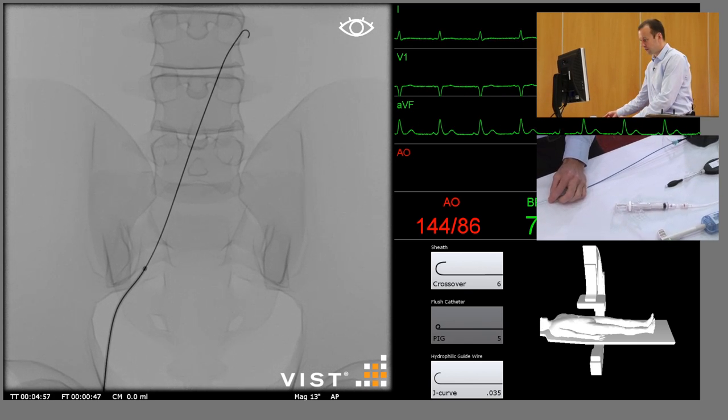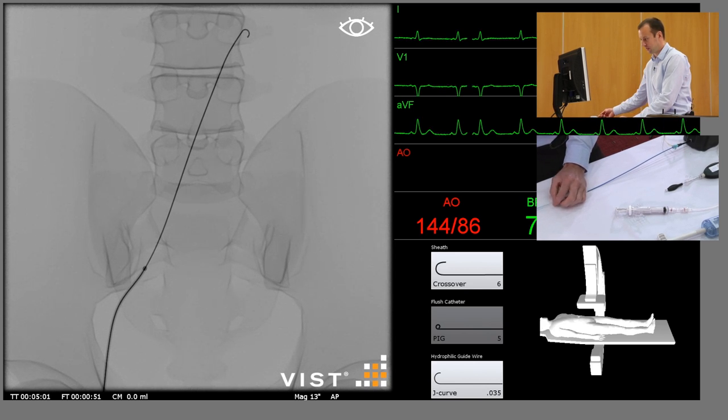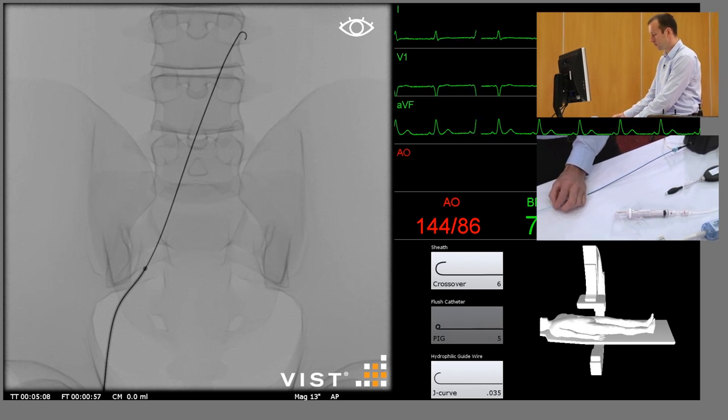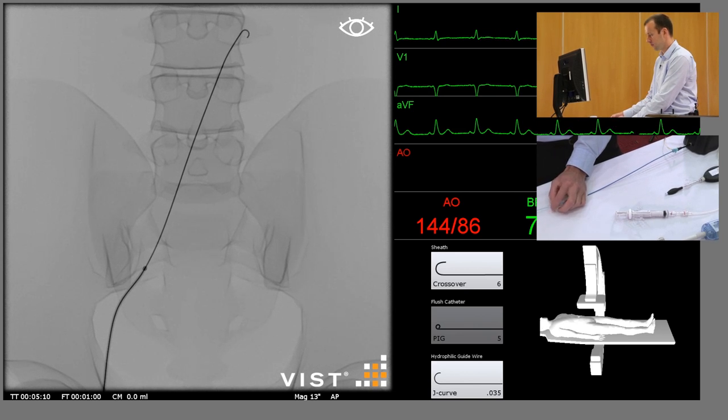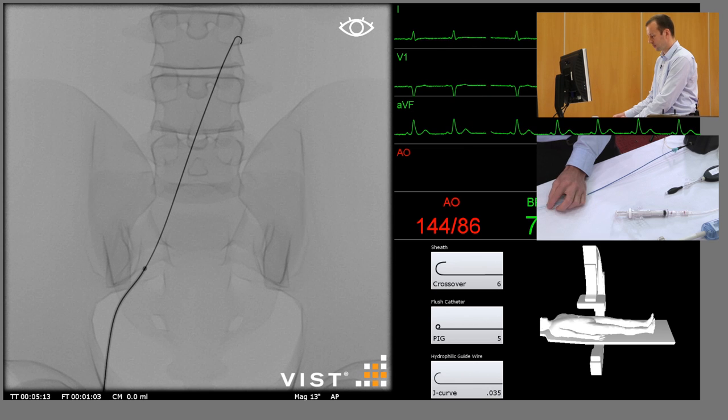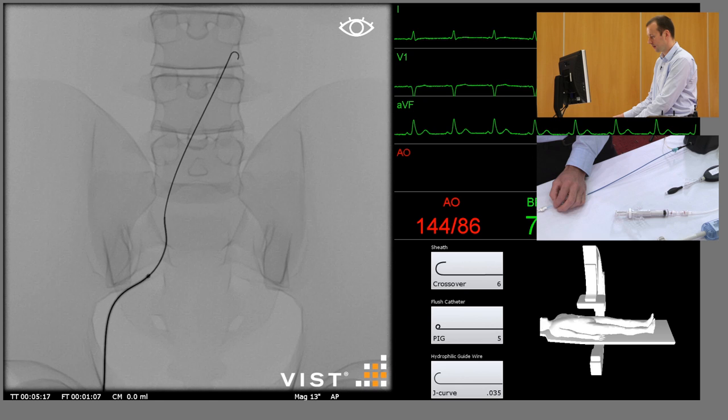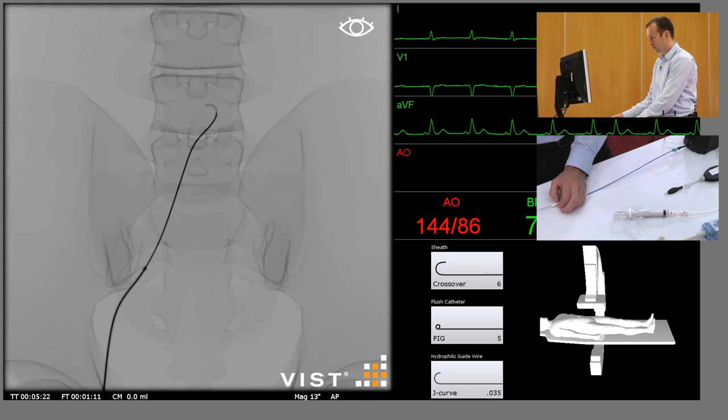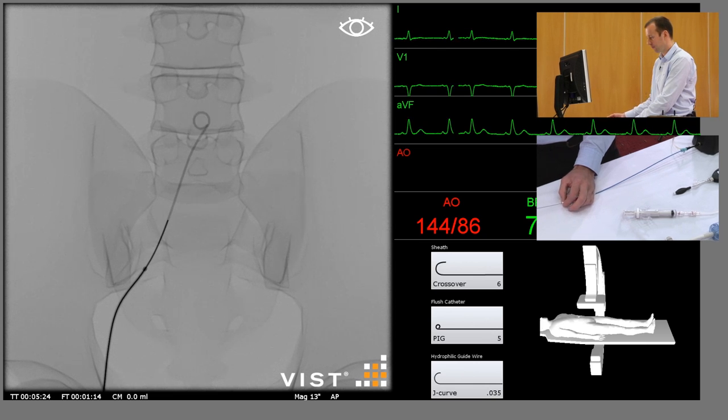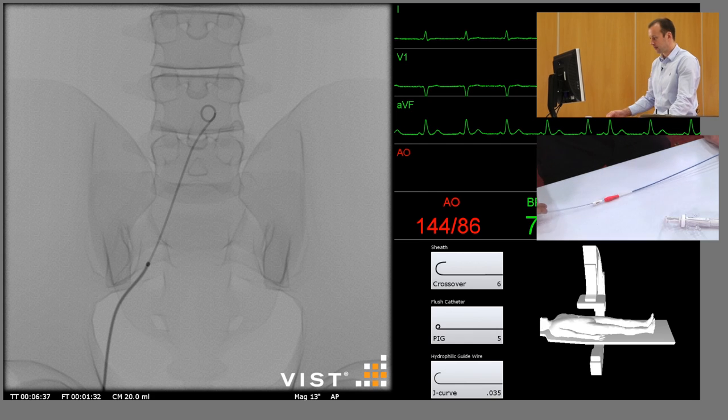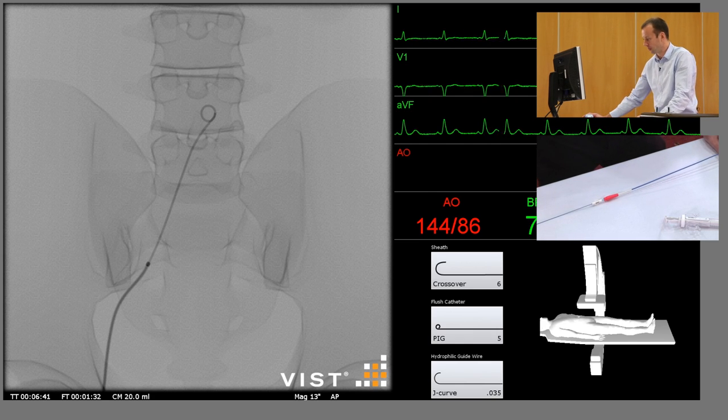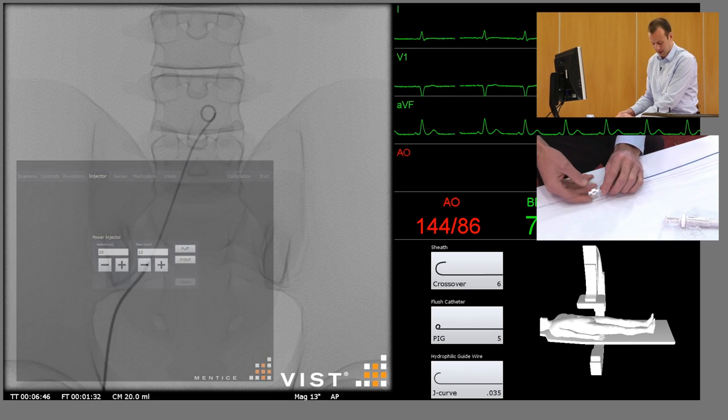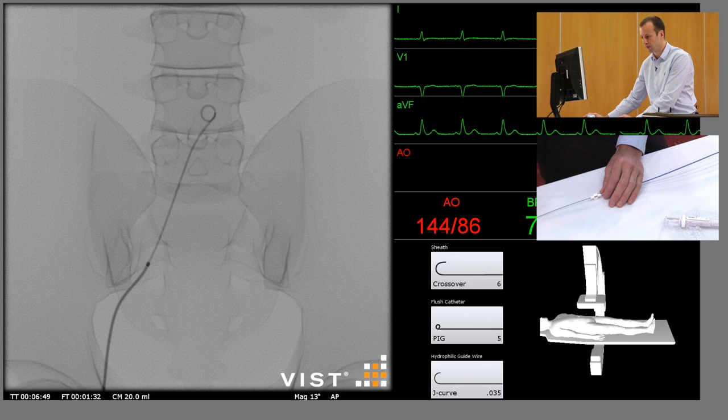Through that sheath we're then going to insert a pigtail diagnostic catheter and we'll place that in the distal abdominal aorta just above the aortic bifurcation. We'll remove the guide wire and let the pigtail form. So with the pigtail catheter in position, we're now going to do an angiogram using the power injector to demonstrate the anatomy we need to treat.